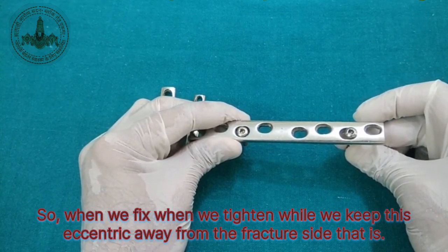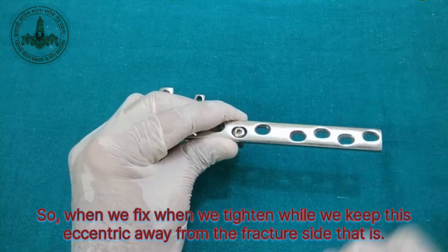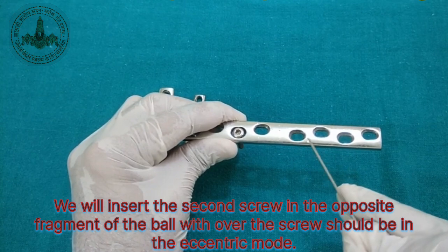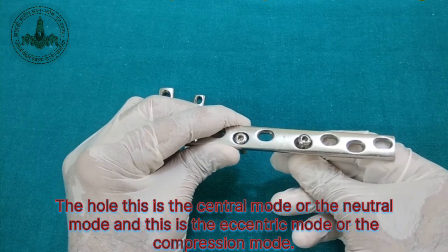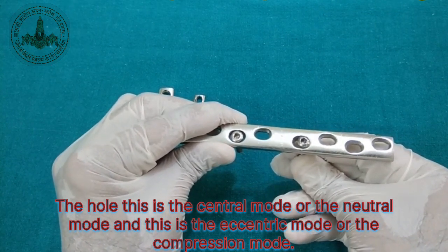While keeping it eccentric, away from the fracture site, we insert the second screw in the opposite fragment of the bone, and that screw should be in the eccentric mode. So we will fix it over here. This is the central mode or the neutral mode, and this is the eccentric mode or the compression mode.